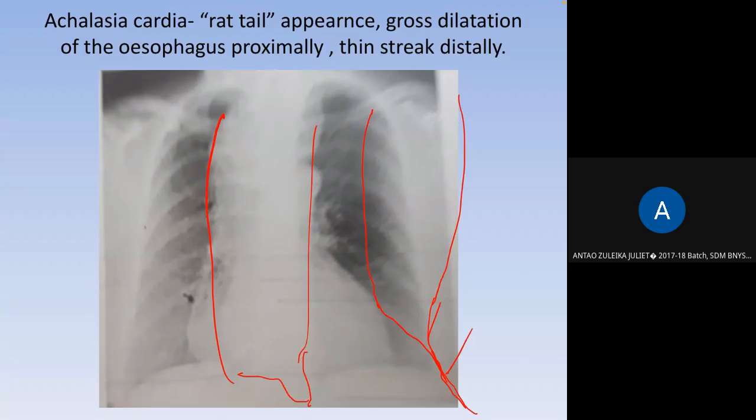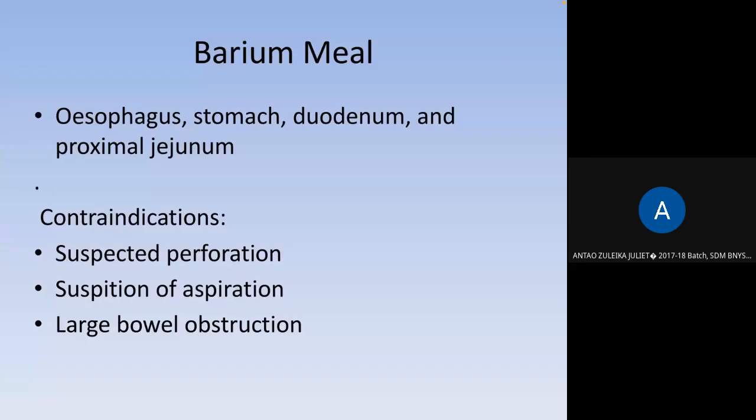Yeah, these are other images. We can guess it's dirty looking. So there is some growth here and some collection. Yeah, these are all usually. This looks like a malignant growth or something. Here we can see there is an esophagus which is again rough and it has gone depressed, maybe because of an ulcer. Next we'll move on to barium meal.